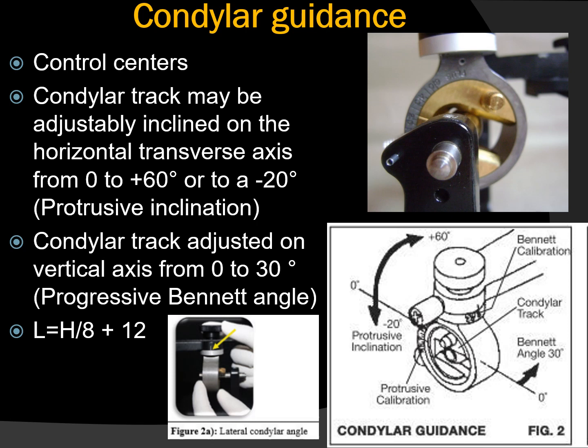Now, the condylar guidances can be of three types. It can be fixed, where it cannot be adjusted, and seen in a mean value articulator. It can be adjustable, where it can be increased or decreased, can be straight or curved, and it can also be custom made, that is seen in a fully adjustable articulator, where the acrylic is custom molded using records of mandibular movement. Now, the condylar guidance is programmed from records obtained from the patient.